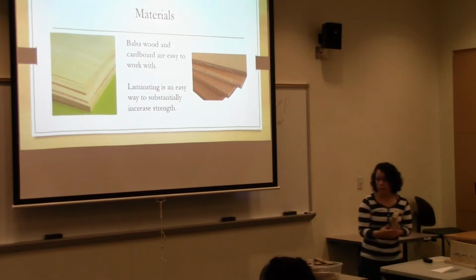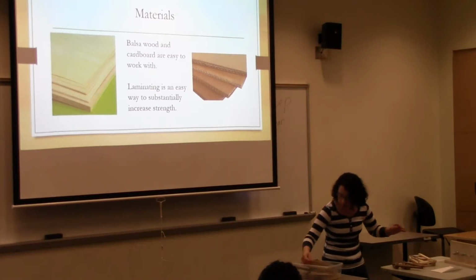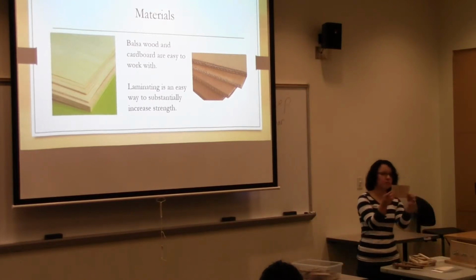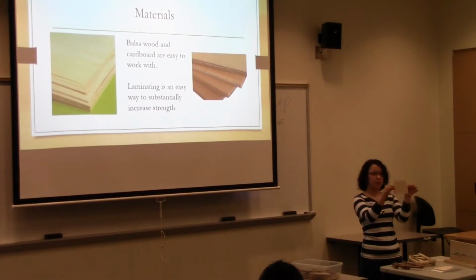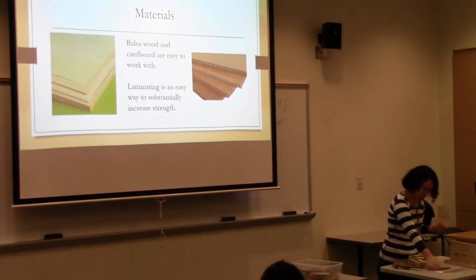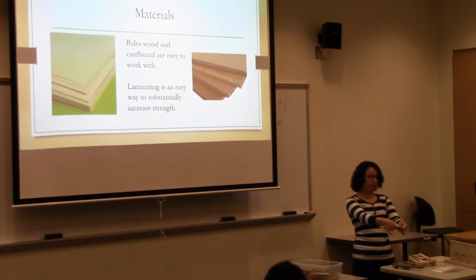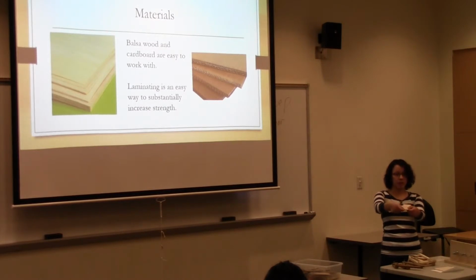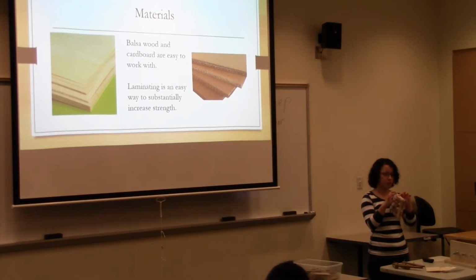The materials that I played with were some cardboard and some balsa wood. And the balsa wood that I used were these little flimsy pieces. And they're really strong in this direction. They won't bend in this direction. But in this direction, they're really soft. But if you cross-grain them, and I just used wood glue for this one, if you cross-grain them, you end up making it really strong actually pretty quickly. Even 3 pieces, you can't flex them anymore. I think I used 6 pieces for these, for each member.